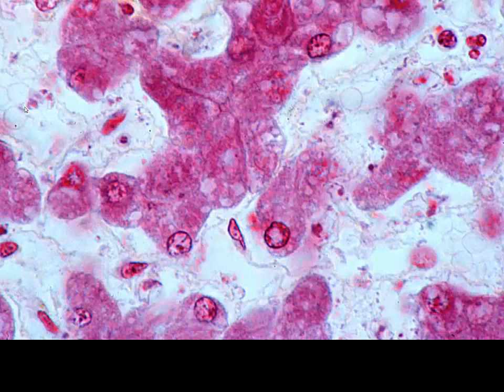Here we have another view, and in this case, the dark line that you see near the center is going to be a bile canaliculus.